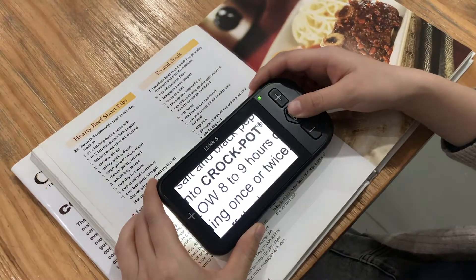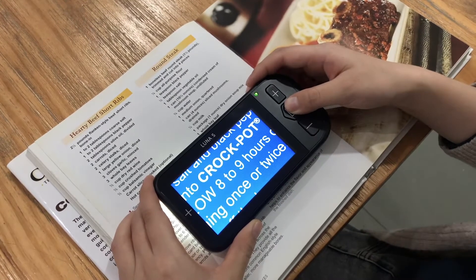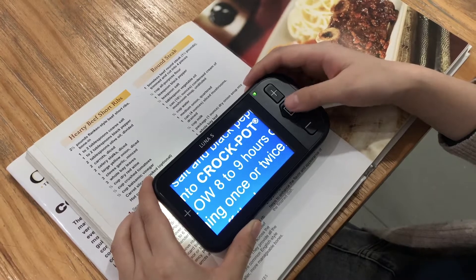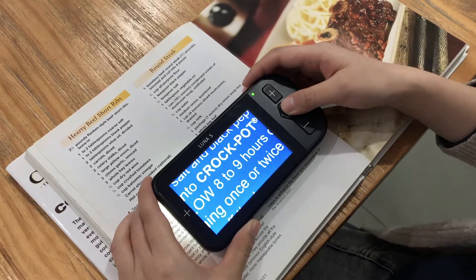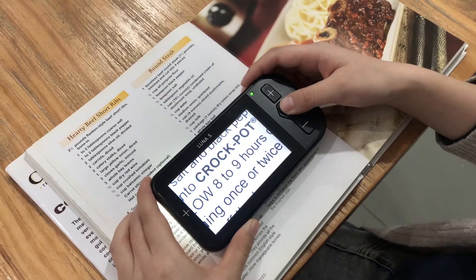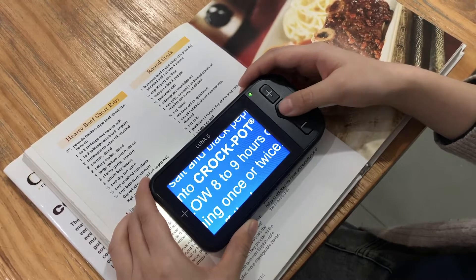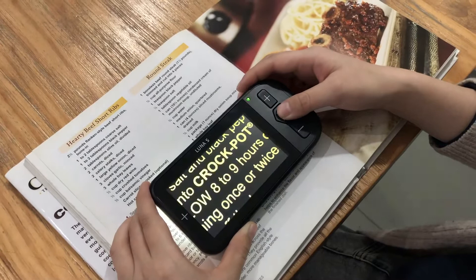Long press the mode button to set your favorite high contrast color. In favorite color mode, there are three color modes: true color, your chosen color, and its reverse. Long press the mode button again to go back to all the color modes.